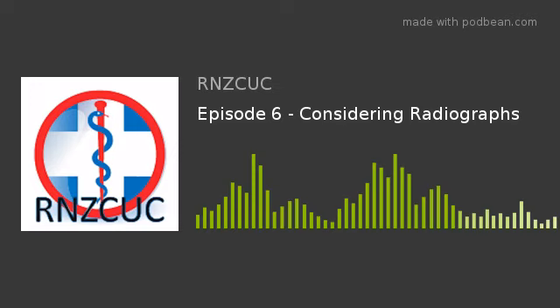And we also then went on to talk about weight-bearing views in general. And the importance, I think, from our point of view, is we're doing a weight-bearing view to get an answer, whether it's stability of the syndesmosis in the ankle, or whether it's the Lisfranc joint in the foot. And it has to be weight-bearing. And so if the patient isn't putting full weight through, you might be falsely reassured with the X-ray result.